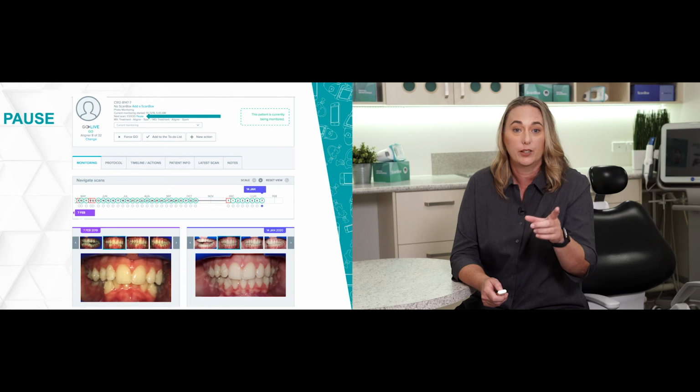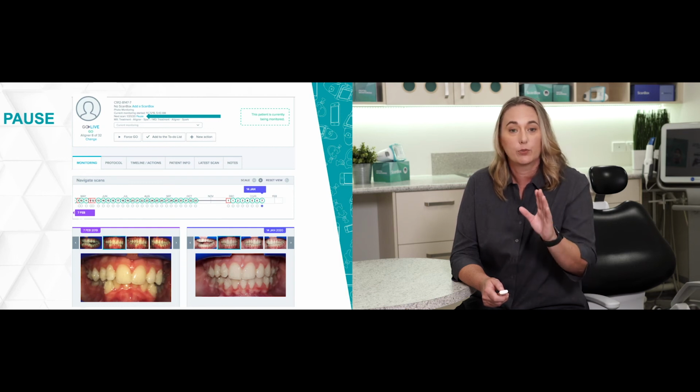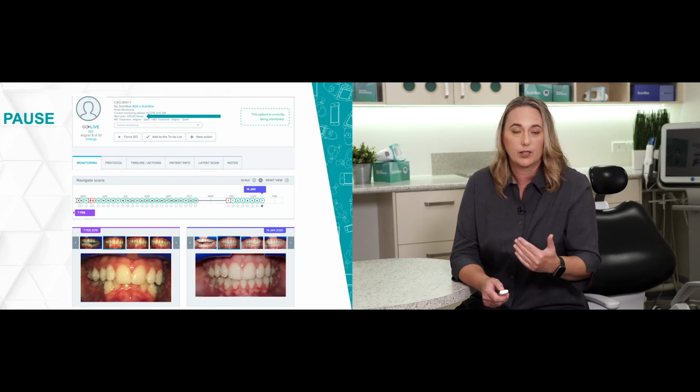The pause feature, and that's a little blue link at the top of the patient card, is really useful. You might want to do this if a patient can't scan for a period of time. Some practices will use this while you're waiting for aligners to arrive. For me, I tend to stop and start monitoring, but that's up to you how you choose to use it.